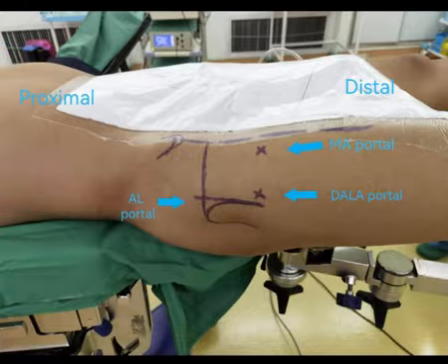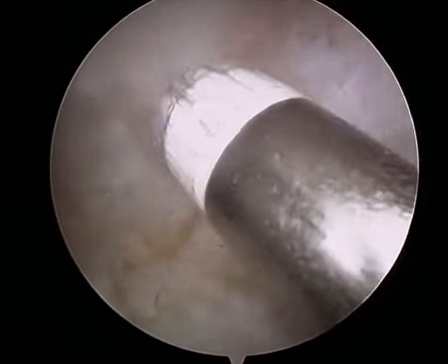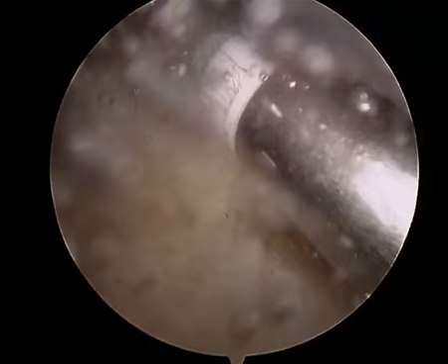This is a patient with right hip FAI. As you can see, after anesthesia, the patient is placed supine on the traction table. Usually, we establish the 3 standard arthroscopic portals: the AL portal, the MA portal, and the DALA portal. Typically, the T-capsulotomy is performed along the longitudinal axis of the femoral neck, through the mid portion of the interportal capsulotomy.